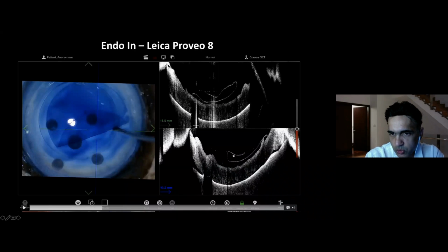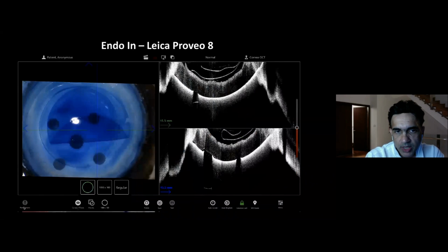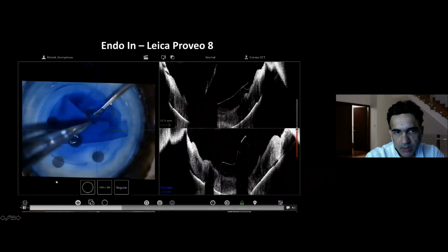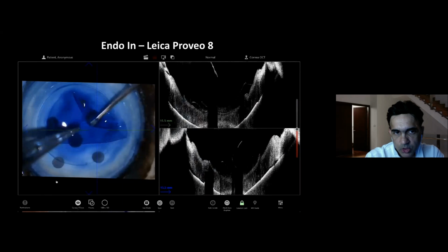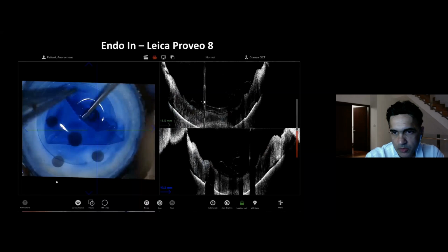So this tells you this is the right amount of fluid, because the two parts of the endothelial leaves are not touching. That's enough on one side. And once I've done one side, I'm going to do the other side as well. So again, I'm pushing down on the top there to get the fold. As I've done that, I lift up the other side, and you pull this over to induce the trifold from the top side.